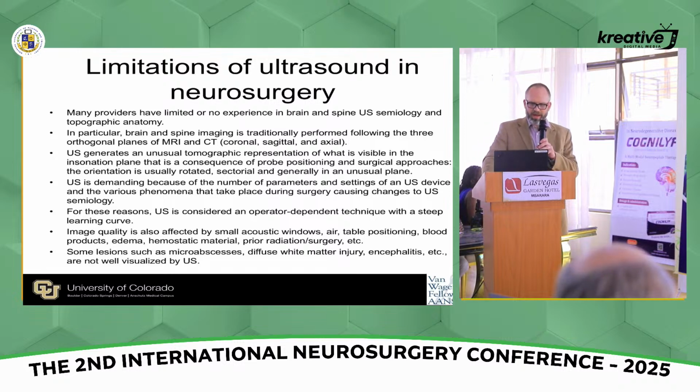Lesions such as microabscesses, diffuse white matter injury, and encephalitis are not well visualized by ultrasound, but some things like microcalcification are actually better visualized on ultrasound than they are on MR or CT.